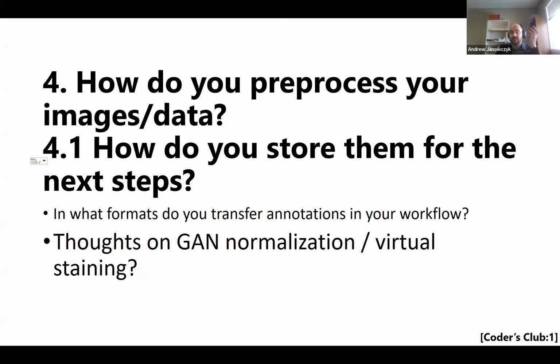And I don't think there's going to be any long-term issue with saving binary images either. I think the serialized formats that we use on Digital Slide Archive do have limitations, like you said, when we're going into many hundreds of thousands or millions of cells on a slide. And we're working to improve that. The issue is not really the storage space on the disk, but that if somebody's viewing that image, they have to stream all that data down from the server to the client. So we're going to try to create some new binary methods to improve that.